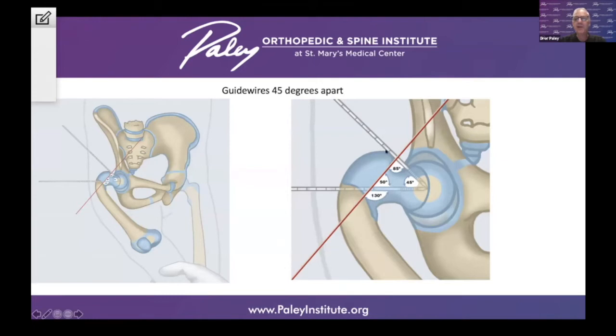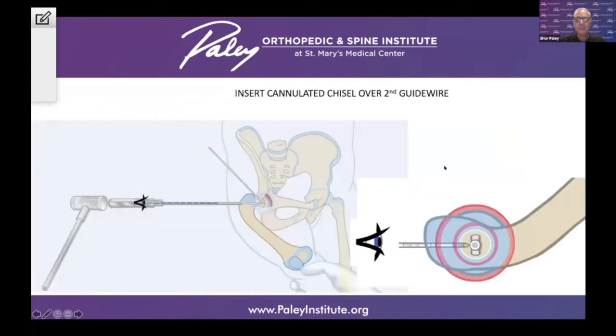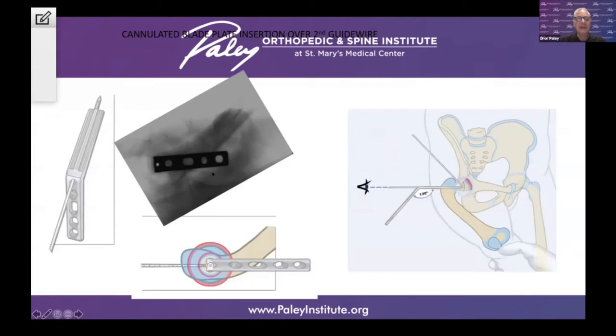It's important to place our guide wires from the tip of the trochanter to the center of the femoral head, and then 45 degrees to that defines where the location of the femoral neck should be. It's difficult to see the femoral neck because it is non-ossified. Using an arthrogram, we can see on the lateral view the ossific nucleus, the neck, and the head, and we want to make sure our guide wires are into the center of the femoral head. We use a cannulated chisel to go up the femoral neck. I find the instrumentation of OrthoP ediatrics particularly useful for this operation for very small children, using the infant blade plate set. The chisel must be perpendicular to the back of the greater trochanter for correct orientation in flexion and extension, so that the plate is oriented relative to the shaft of the femur correctly to the proximal femur.